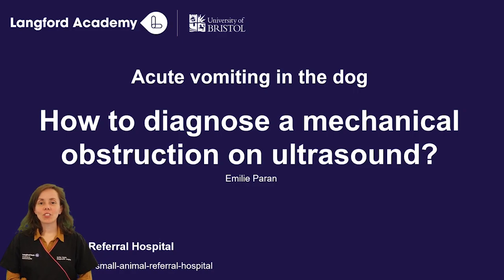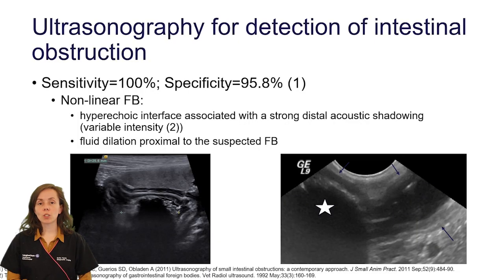I'm Emilie, one of the radiologists working at Vets. I'm going to show you here how to diagnose a mechanical obstruction on ultrasound. Ultrasound has a reported perfect sensitivity and almost perfect specificity.